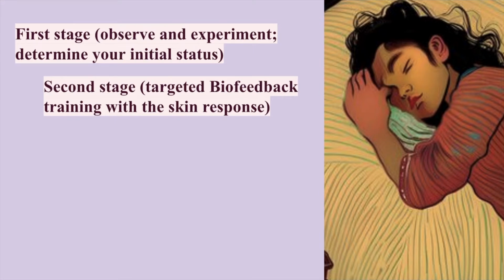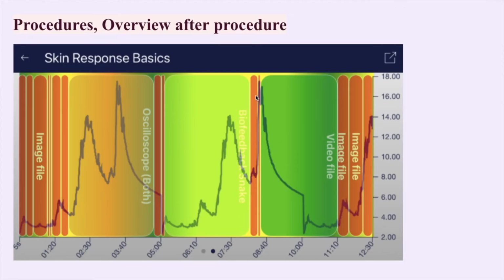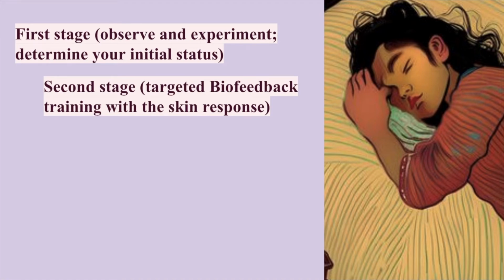So now have a look at the complete curve and its average tonic level after the first 10 minutes. Does it rise or fall in certain phases? So we're looking at the phasic fluctuations now. Or is the general level constant throughout the measurement? If the general level is constant, we're looking at this steady state. And you can see there's more phasic firing here. There's some increases. Generally it's increasing, but it's also decreasing. It's much more fluctuating on this graph.